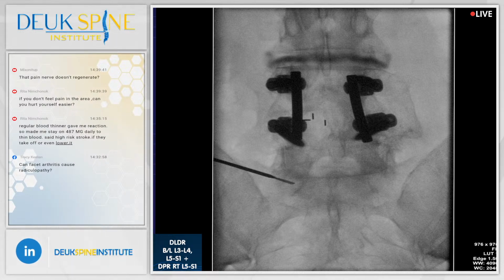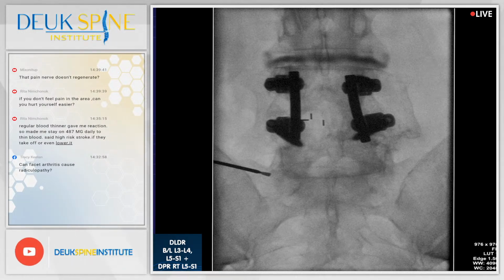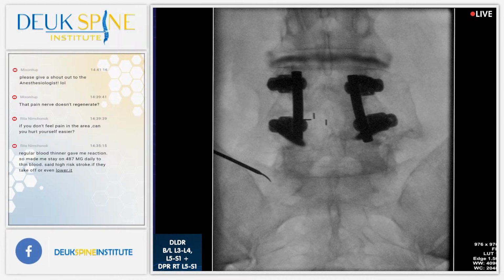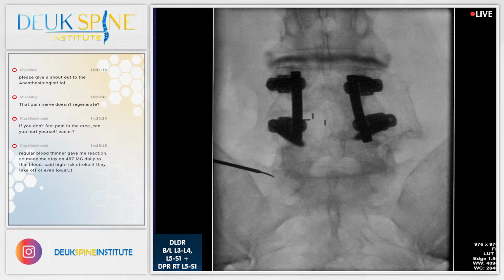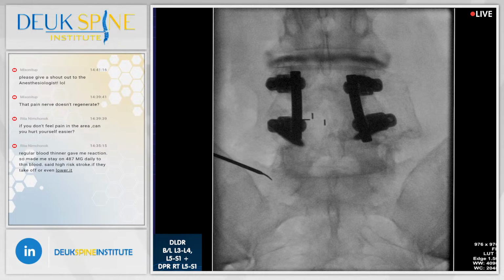Any questions? Just one question coming from Mixing It Up on YouTube, asking: does the pain nerve regenerate? No. The pain nerve after our procedure will not regenerate, but after an RFA it will. The difference is the way we do this treatment, it's designed to not let the pain nerve regenerate.